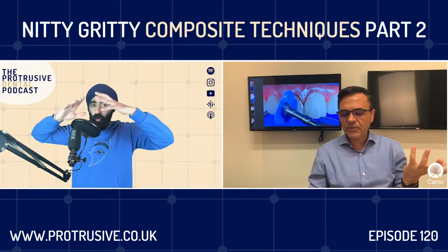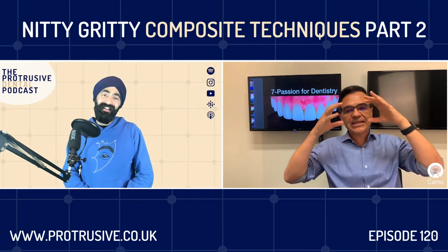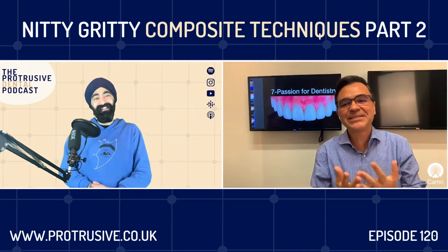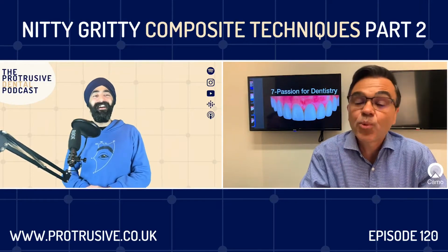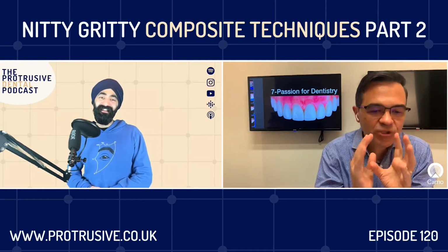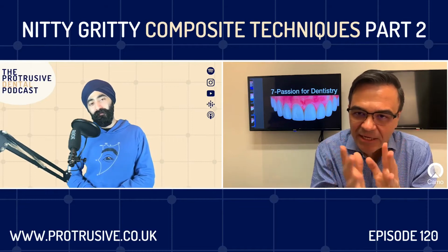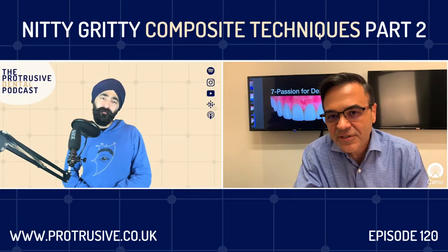How do you stop the water from splattering everywhere? I place napkins on my patients' eyes, and I put some glasses, and yes, it's messy. It's messy, and I tell my patients, I'm giving you a second shower today, but it's worth it, because then you get beautiful, like I tell you, surface on your composite, and you know what? You can control the glazing on your composite. You cannot control the glazing on your veneers.